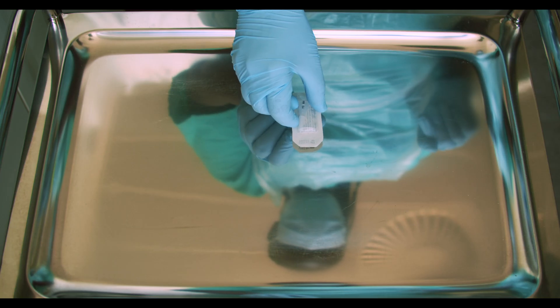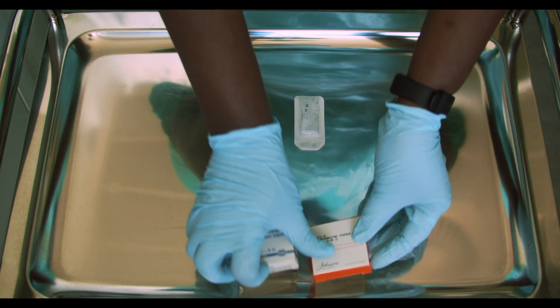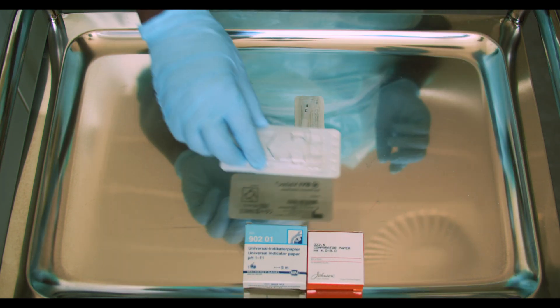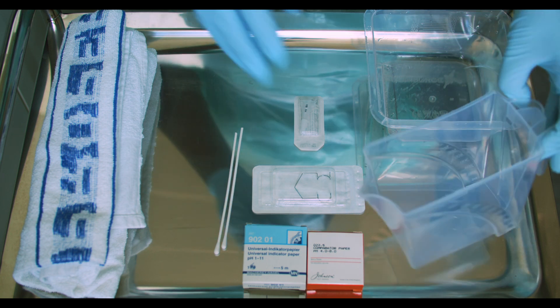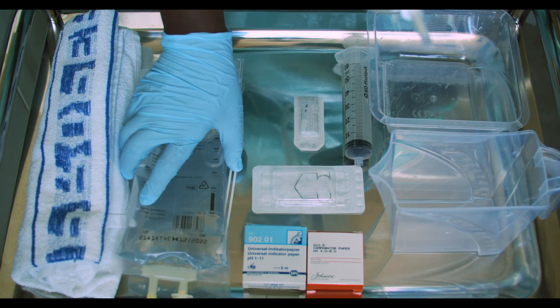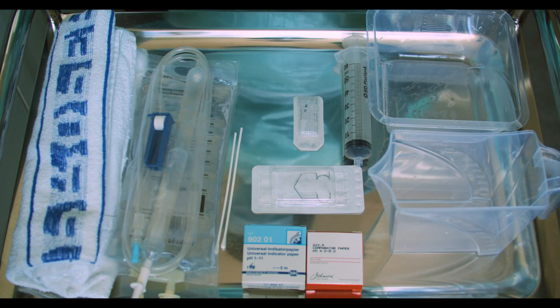Wash your hands and don PPE. You will need local anaesthetic drops, pH paper, speculum, towel, bowl, cotton buds, a jug, syringe, giving set, and clean irrigating fluid. Prepare all the equipment.